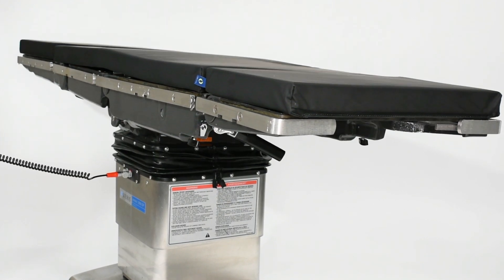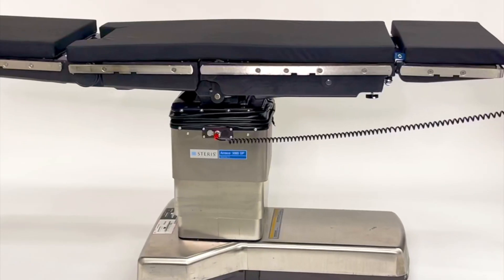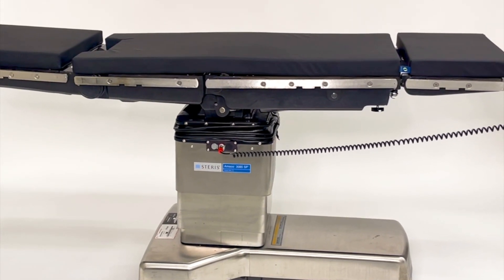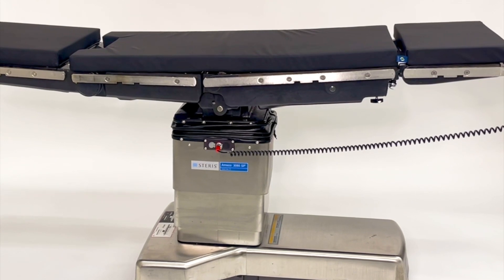With extensive options on patient positioning, the 3085 SP hydraulic system provides safe and ergonomically structured movement for surgeon access.